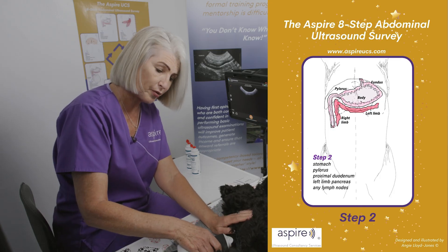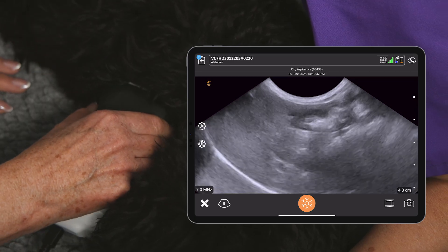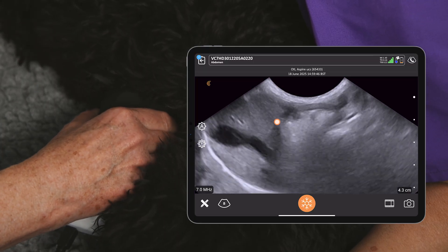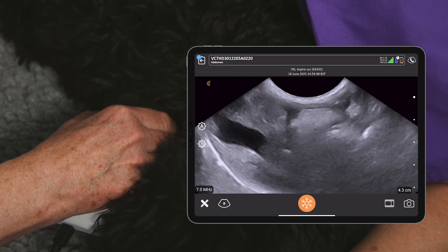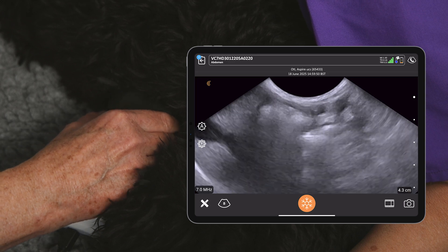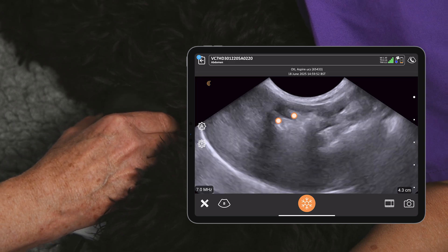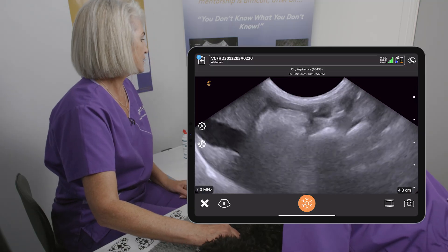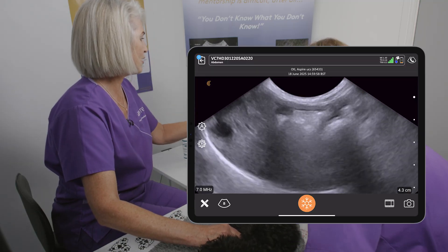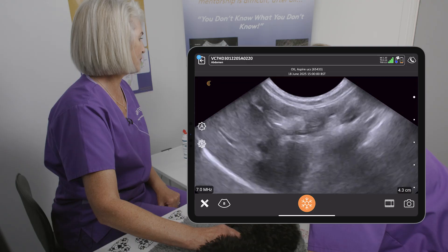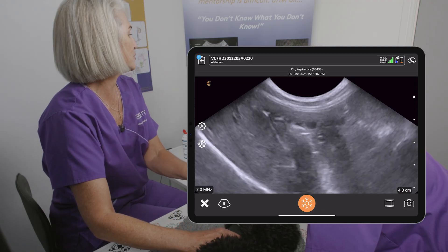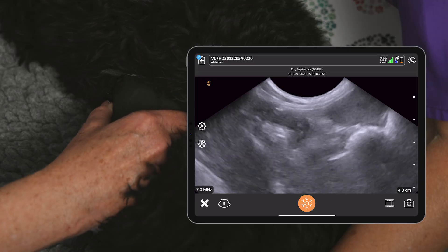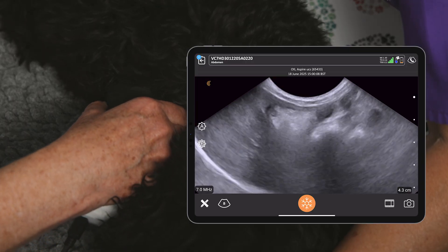Let's place the probe long axis in the midline sub-xiphoid — here we can see our stomach. We've got these little involutions on that mucosal/luminal surface; these are the rugal folds of the stomach, which is quite normal. We want to have a good look around globally at the stomach as we move all the way up, fanning up towards the ceiling, then back down, fanning down towards the table.